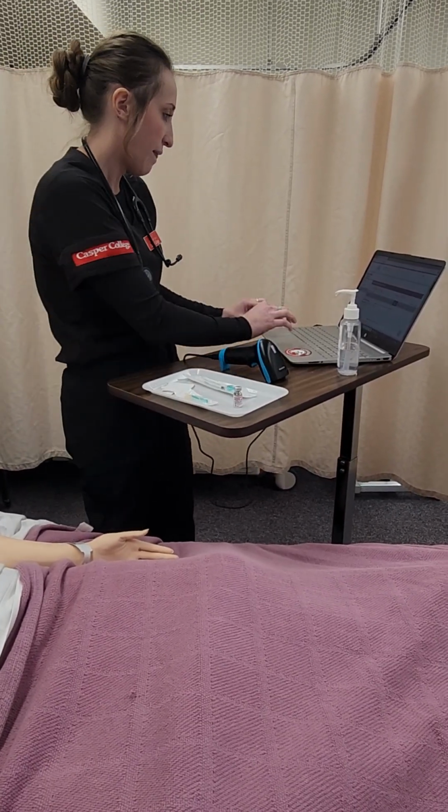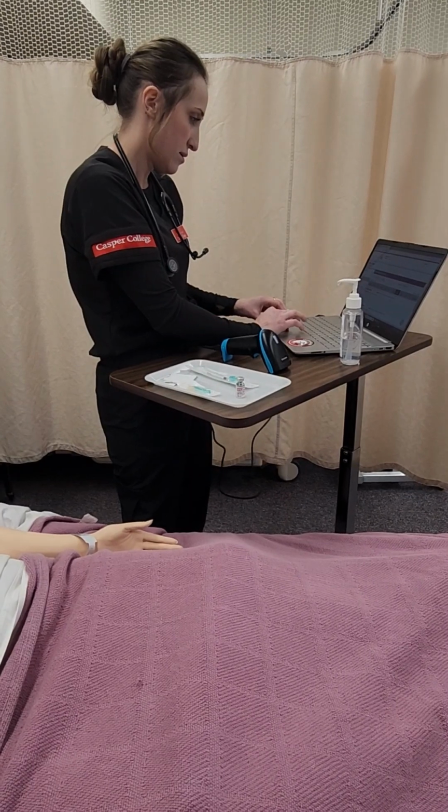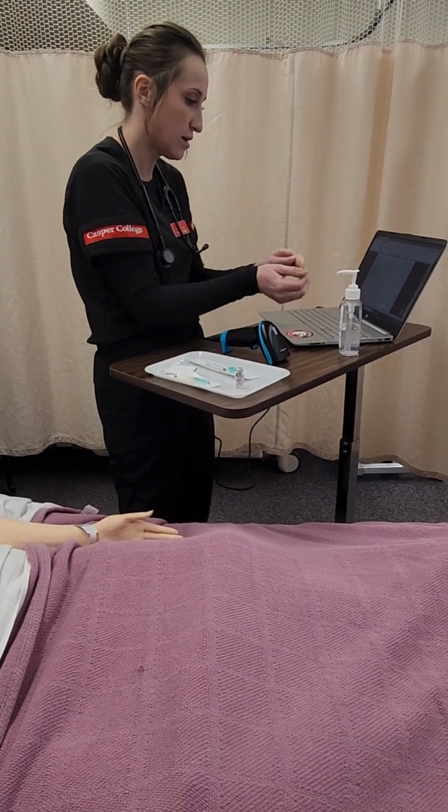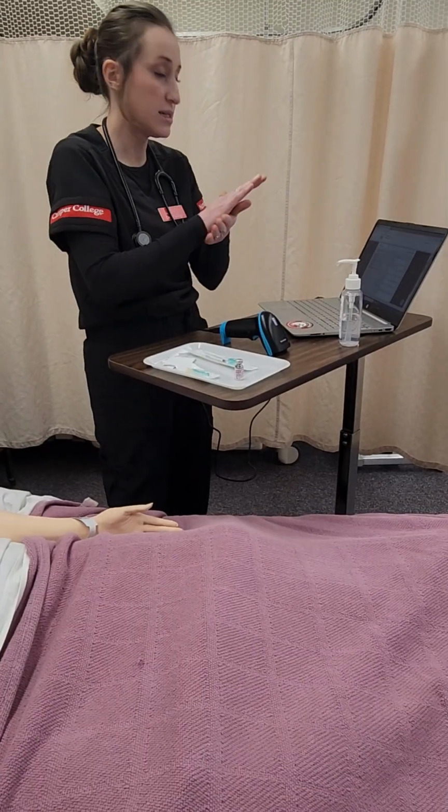Okay. See if that'll bring this up. All right, I'm going to put on gloves and get this ready for you.